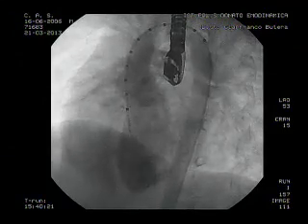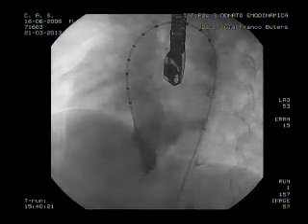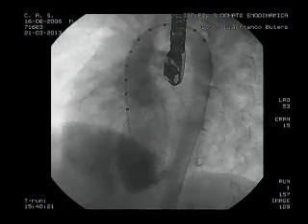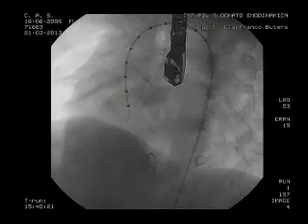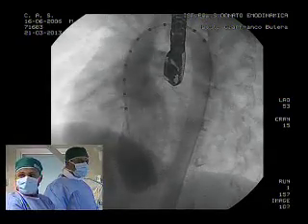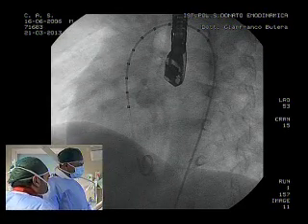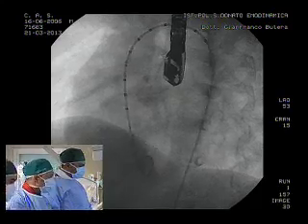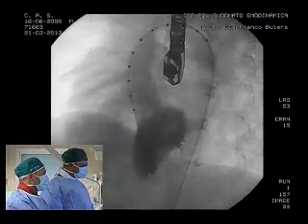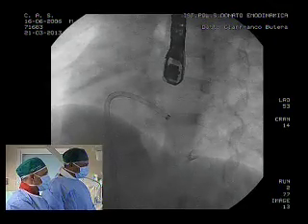There's the angio, as you can see, in the left ventricle. I was a little bit surprised when I saw the jet. So there's two kinds of things. The jet itself measured about 4.25 millimeters, and just proximal to the jet, stop right there.